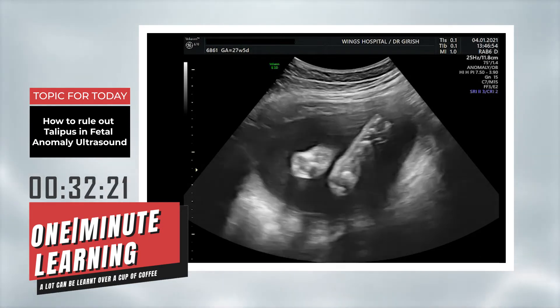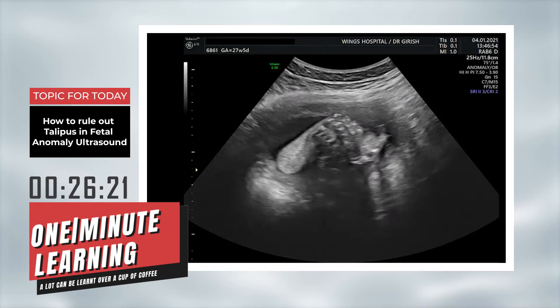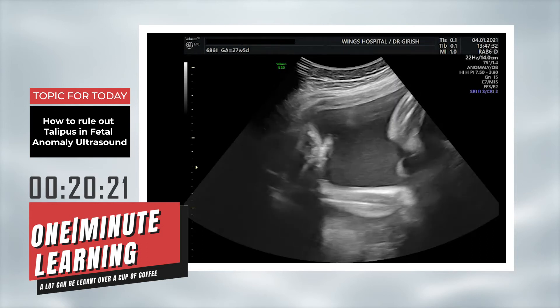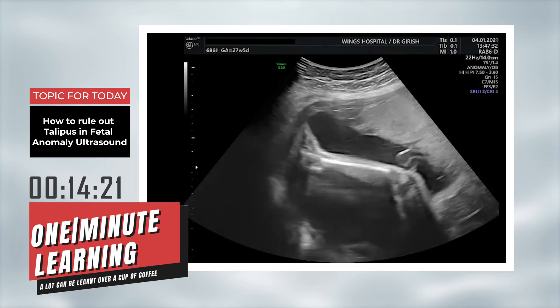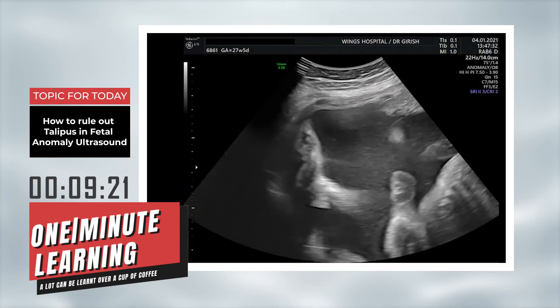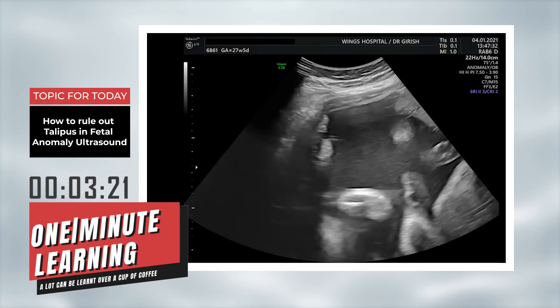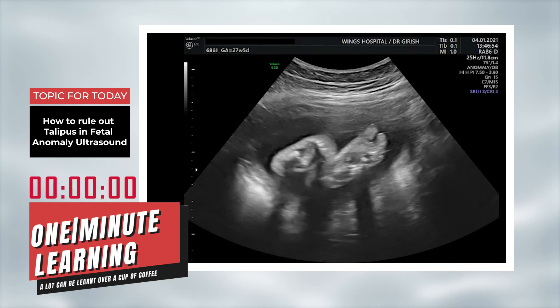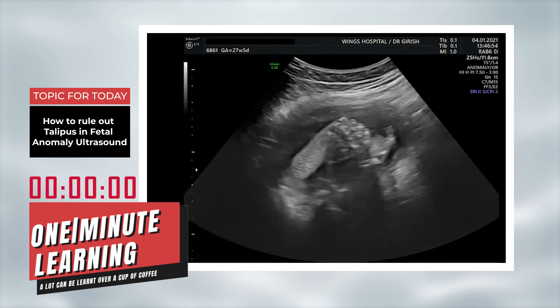This is a fetus of 27 weeks 5 days where you can see both soles of the feet side by side. In the same fetus, in longitudinal section, you can see the tibia, fibula and foot. So if you can't see the plantar surface of the feet when you see the tibia and fibula in longitudinal axis, you are ruling out talipes in this section. The key message is: when you see both soles of the feet side by side, you can easily rule out talipes.